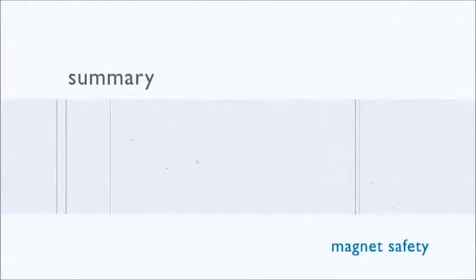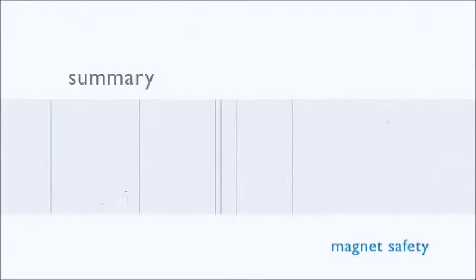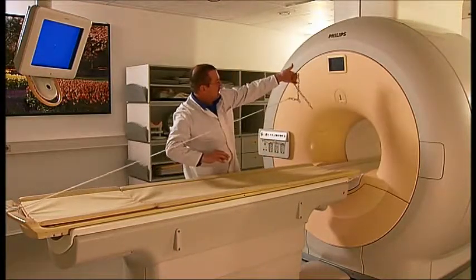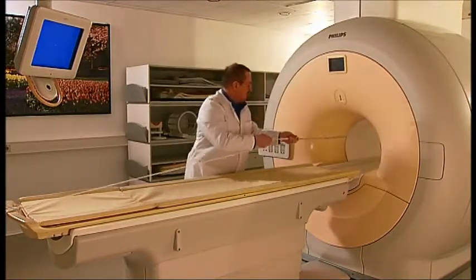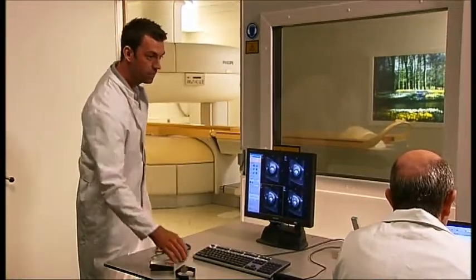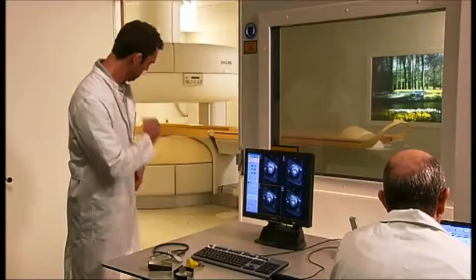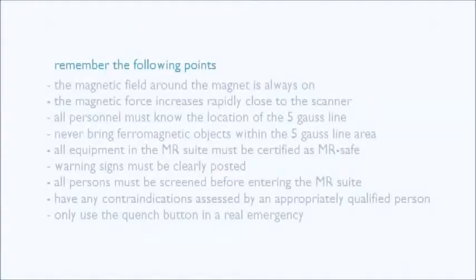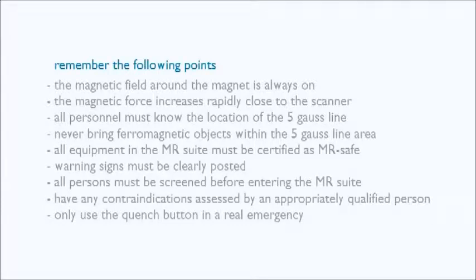Summary. The magnetic fields around modern MR scanners are becoming increasingly stronger. Extra safety precautions are therefore essential and should never be forgotten. Remember the following points. The magnetic field around the magnet is always on. The magnetic force increases rapidly close to the scanner.